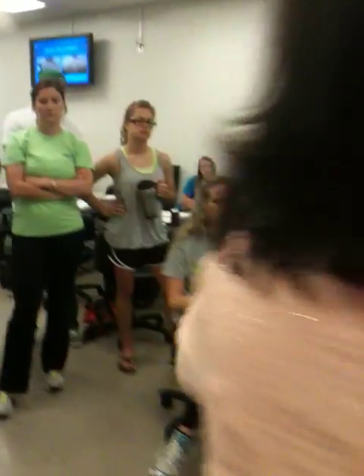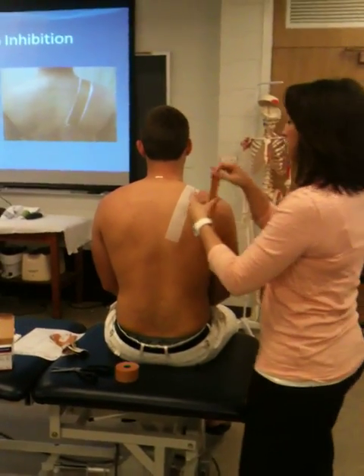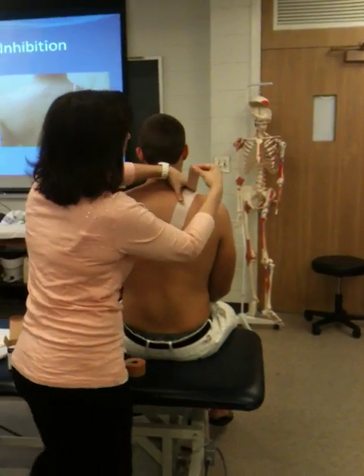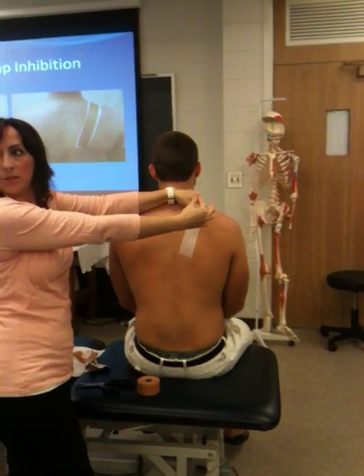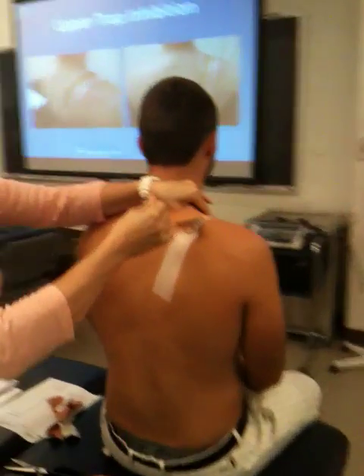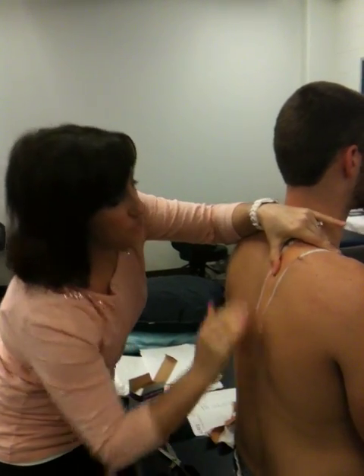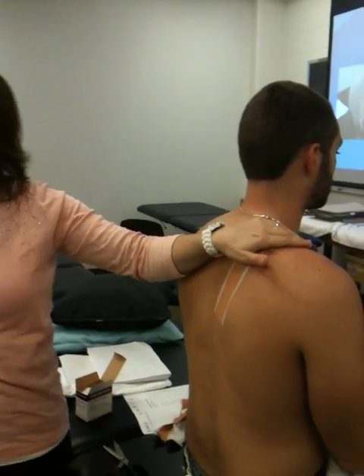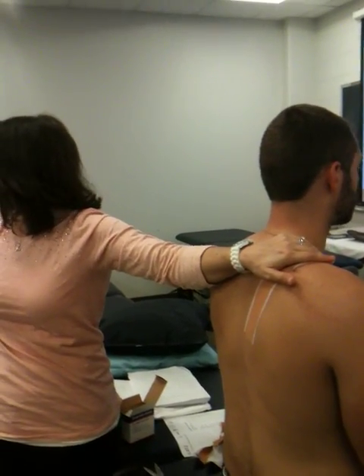What you're going to do with this piece is put a lot more tension than that postural piece. So I anchor down on my front. I'm going to switch directions so I can pull here. I'm going to unload the tissue by pinching it. I'm now going to give it a nice, strong pull down. You see that little wrinkle under there? So you know the tissue's been unloaded, and now you put the pressure on to inhibit it, okay?